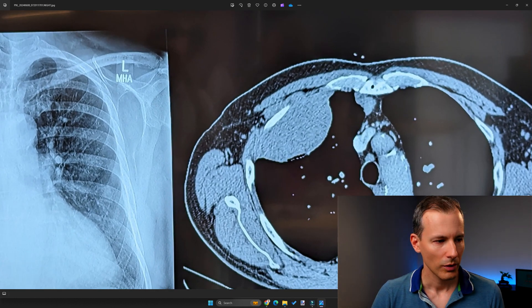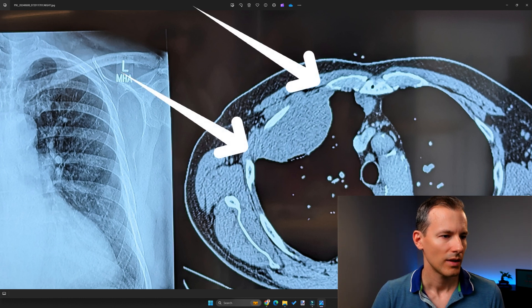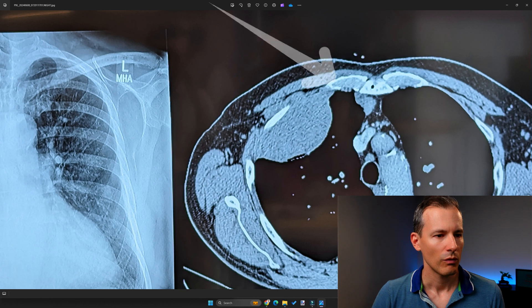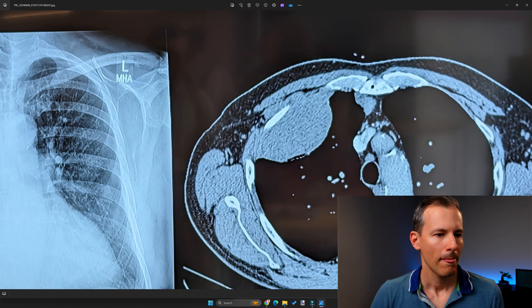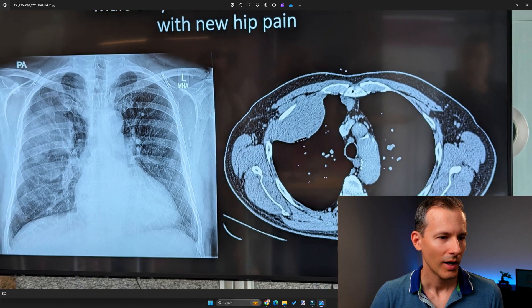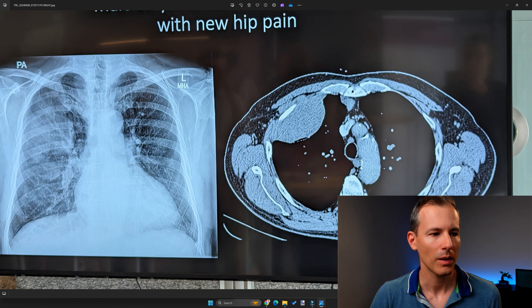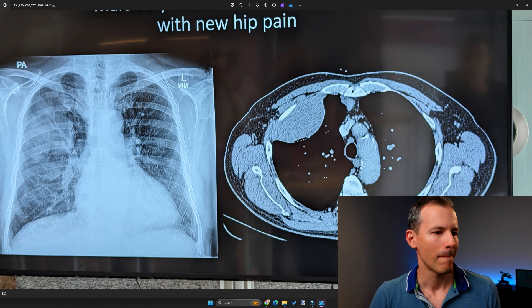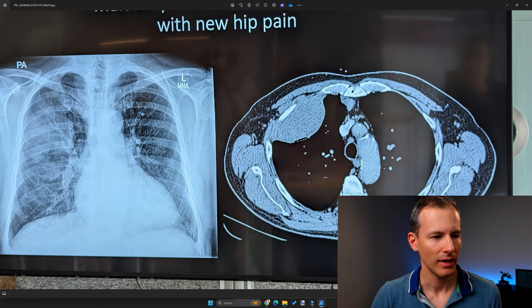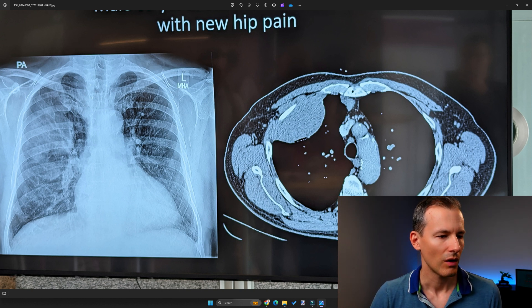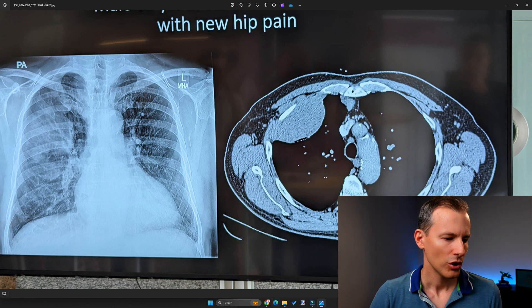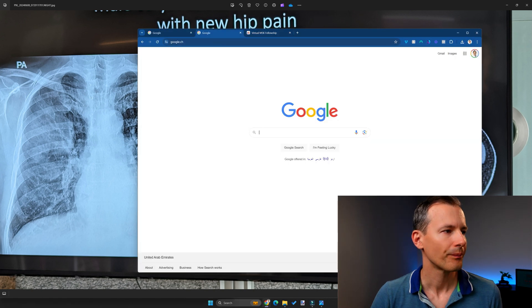Looking at the tumor, I was thinking it's a pleural tumor — the angles look more like a pleural mass sitting there, not a lung mass per se — and with an additional nodule it fits a pleural space lesion. The differentials that come to mind are mesothelioma, carcinomatosis, and other tumors in this region. The lack of effusion makes mesothelioma a bit less likely, and we don't see any calcification, so asbestosis is off. One idea I had initially was solitary fibrous tumor of the pleura.